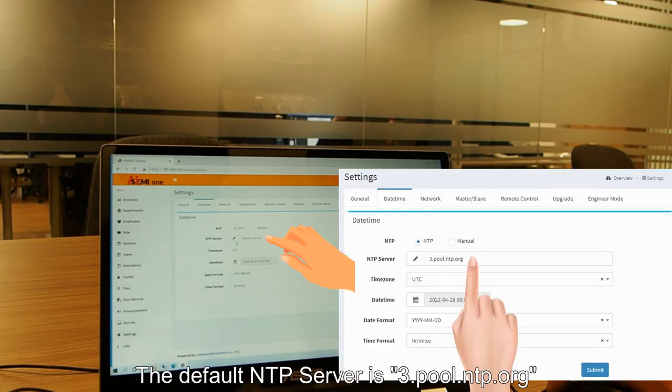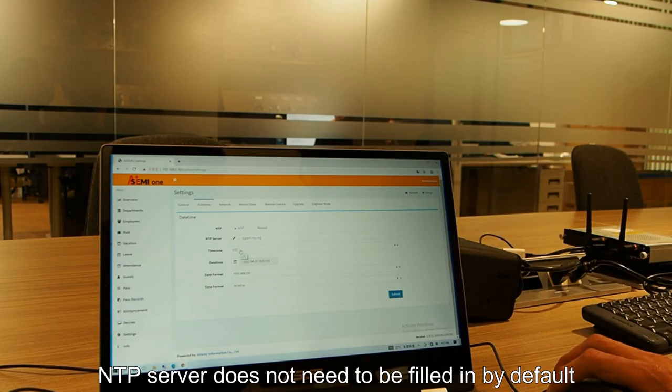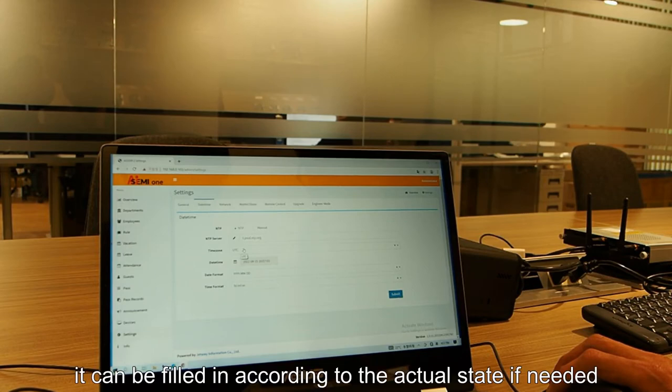The default NTP server is 3.pool.ntp.org. NTP server does not need to be filled in by default. It can be filled in according to the actual state if needed.